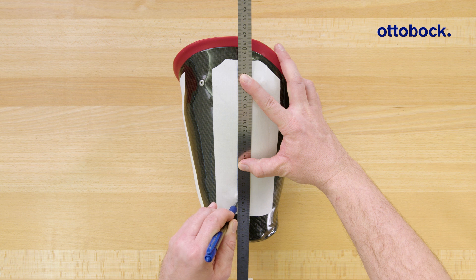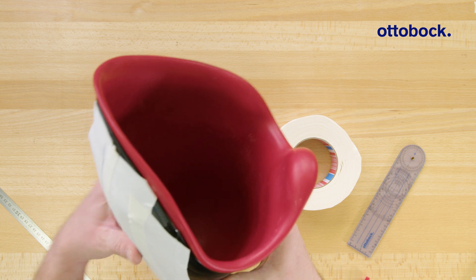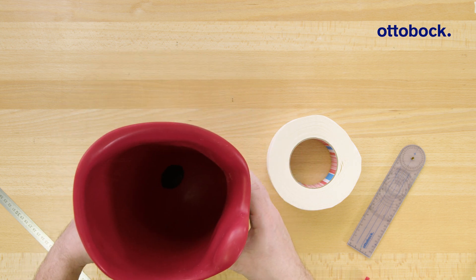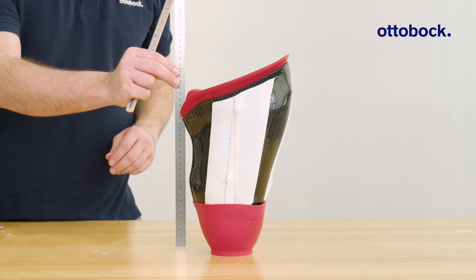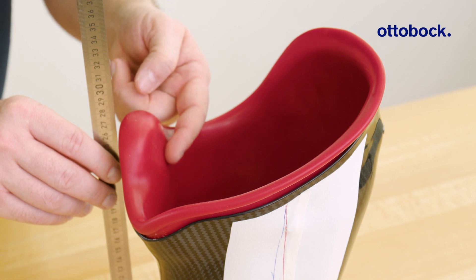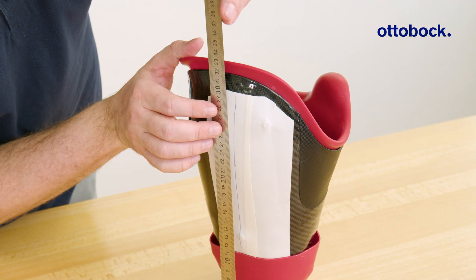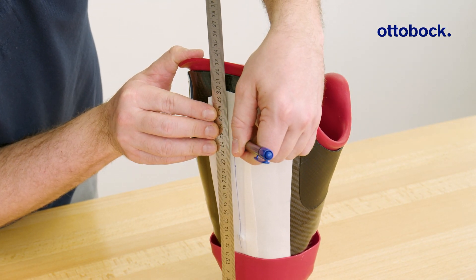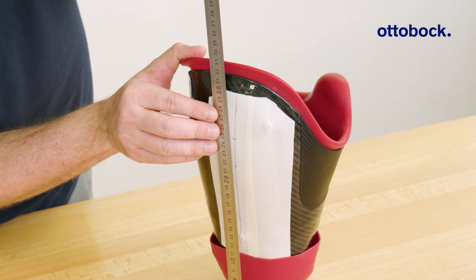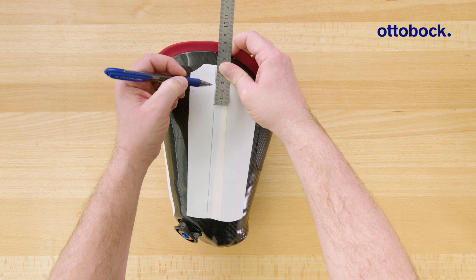Now we can determine the socket reference point. Place the socket into the plaster cup so that the reference line is aligned with the plumb line. Measure the distance from the workbench to the tuberosity. Transfer this length to the line drawn on the lateral side, then add three centimeters to get the socket reference point.